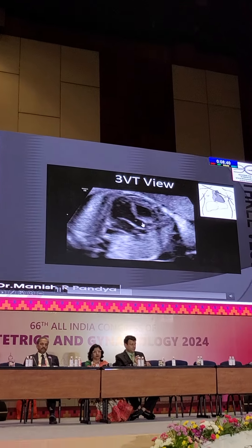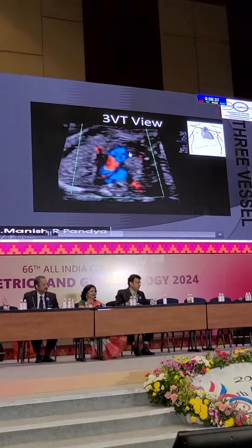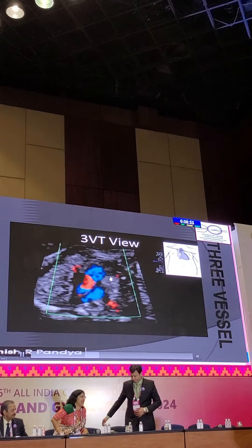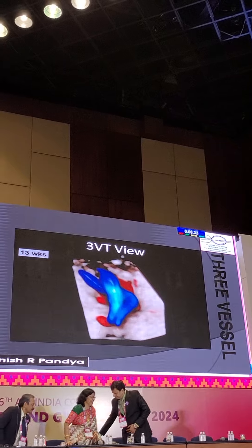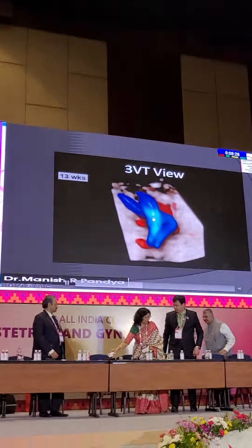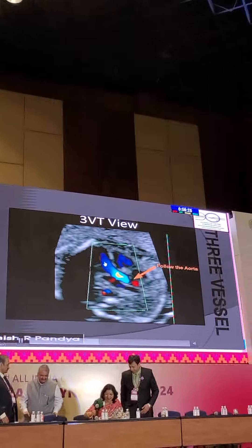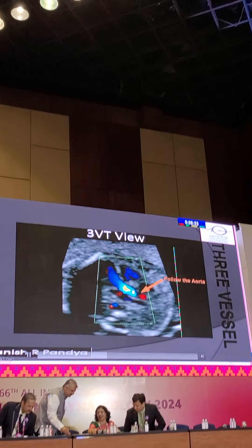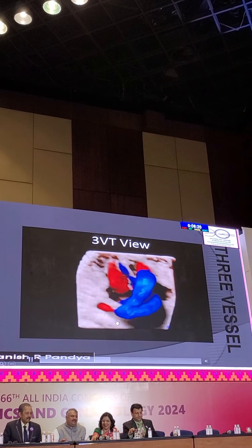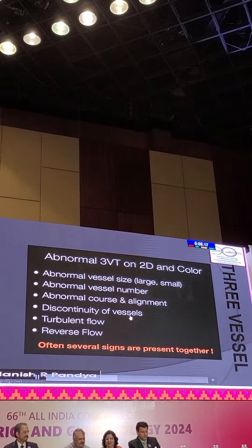Always follow the aorta. Once you follow the aorta, the LVOT — the next view will show the pulmonary, and the third view will show pulmonary, aorta and superior vena cava. This can be found as early as 13 weeks of gestation. Typical crossing vessels — pulmonary is always larger. Follow the aorta, then go for the pulmonary artery, then the triple-vessel tracheal view — 3VTV. That is the most important view after the four-chamber.